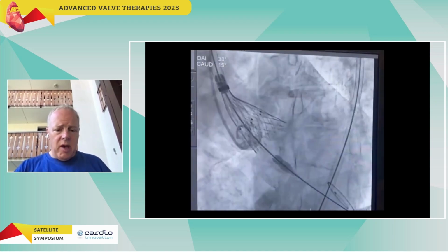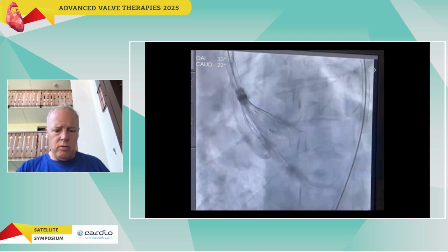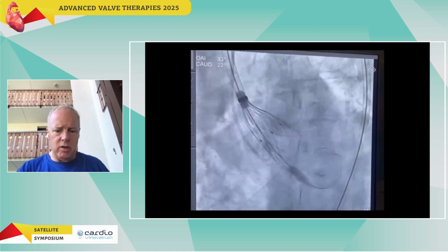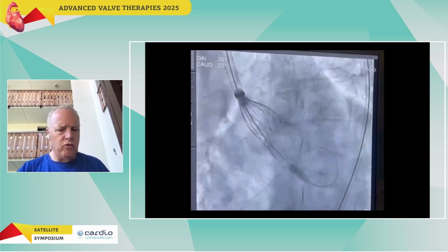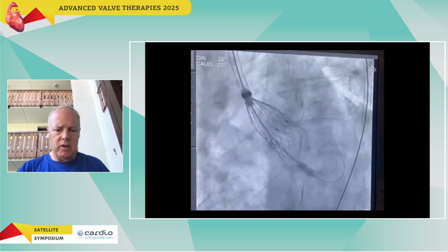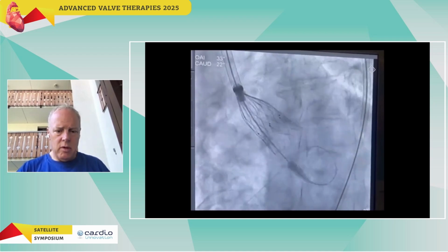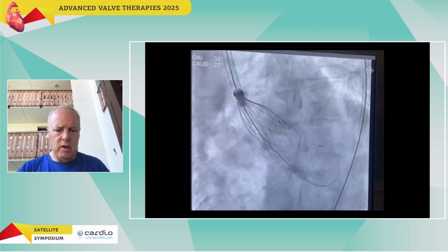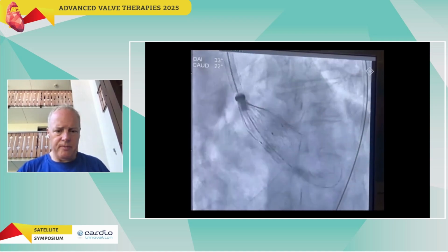Implant depth in this case turned out to be excellent, maybe 1 or 2 millimeters below the non-coronary cusp, so no need to reposition in this first in-human case. And so the valve was detached, again quite slowly, just to allow the valve to orientate itself. But we don't really see any tilting as we detach the Allegra with the Imperia delivery system. The inflow stays very stable. Sometimes a little bit of self-centering, but again, you can go a little bit faster than you see in this video, but this was the first ever experience, so the operators were being very, very careful.